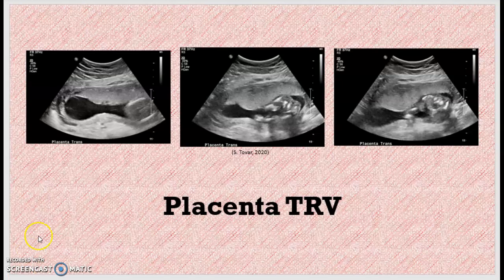And then when you're scanning, I have learned that you can move around quite a bit on the patient. It's usually not just in one area, if that makes sense. So I learned that usually you can image it in one area almost, but you can really move around the patient to get these images, if that makes sense.